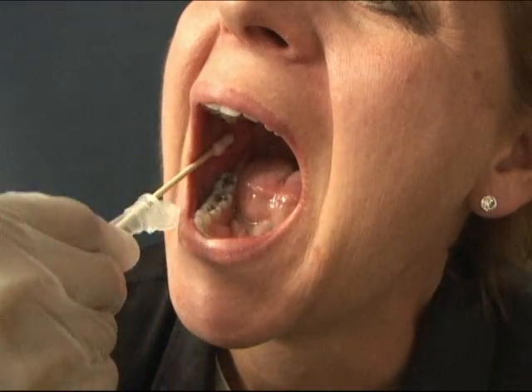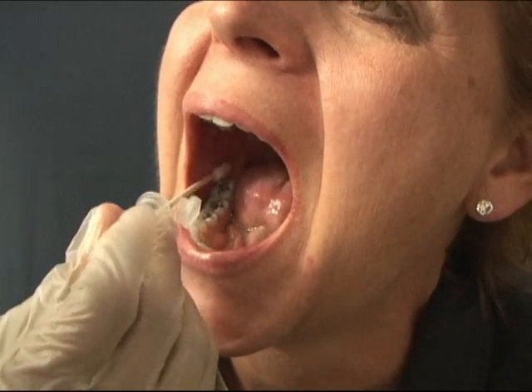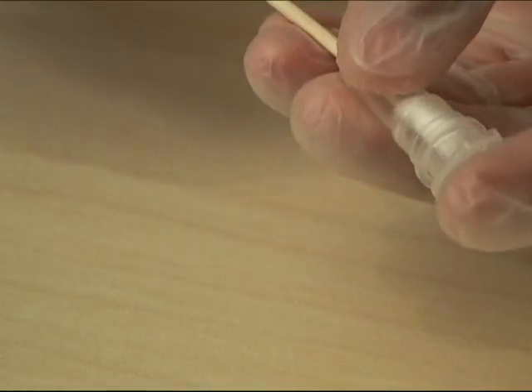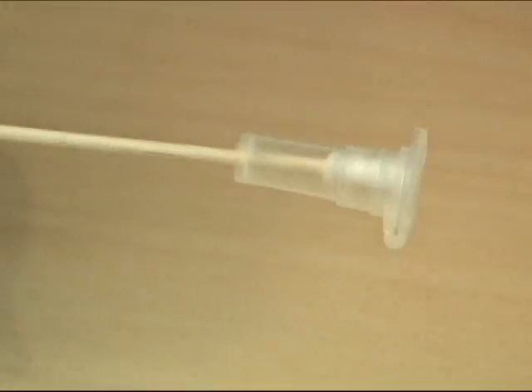Now you want to swab somewhat vigorously. You don't want to hurt the person or the child, but you want to make sure that you get a really good swab on there. Okay, so there we go. Now when closing it, it's that simple. Okay? After we've closed our cap, we're going to take our envelope.